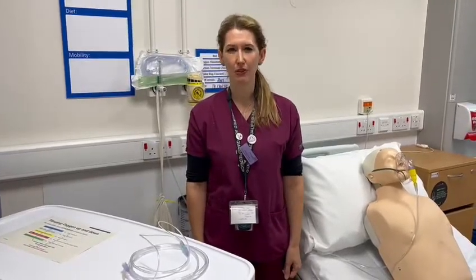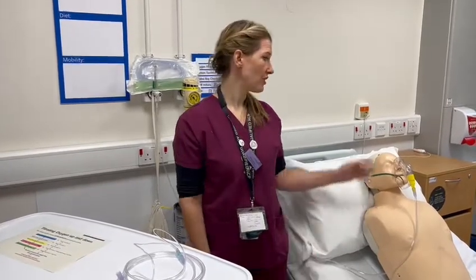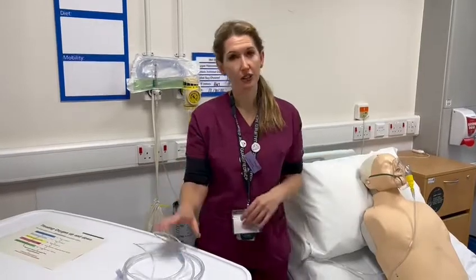Hello, my name is Kirsty Lang. I'm one of the respiratory ACPs working here at Harrogate Hospital. This video is going to go through how to convert your patient that's on Venturi to the nasal cannula.